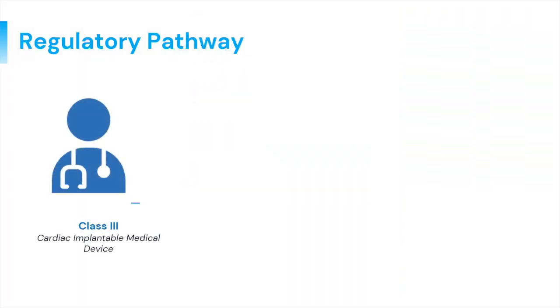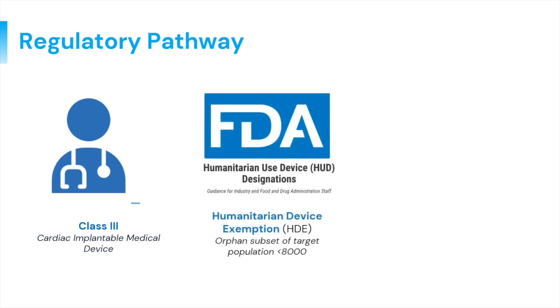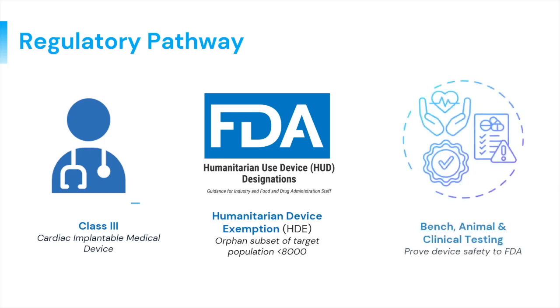The Koi is a Class 3 cardiac implantable device. With an orphan patient subset of less than 8,000, we plan to apply for a humanitarian use device and follow the humanitarian device exemption pathway. The HDE pathway requires us to provide sufficient information to determine that the device does not pose a significant risk to patients and that the probable benefit to health outweighs the risk of injury or illness.